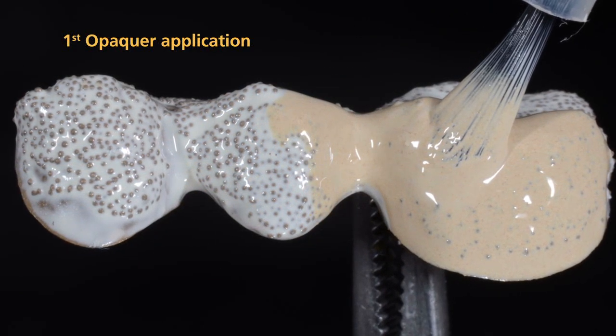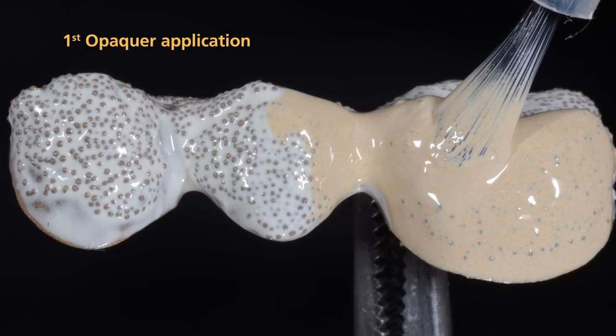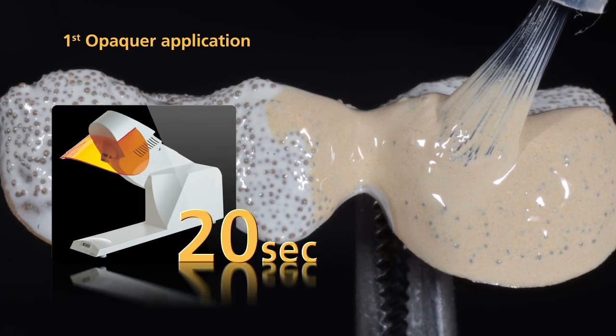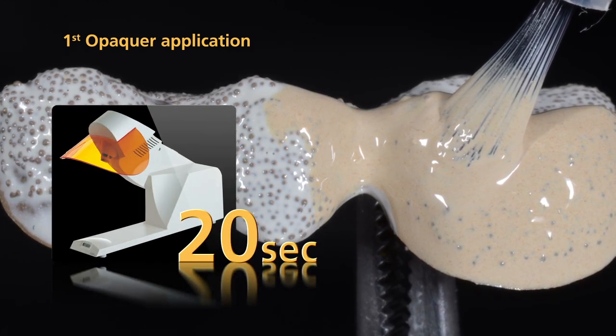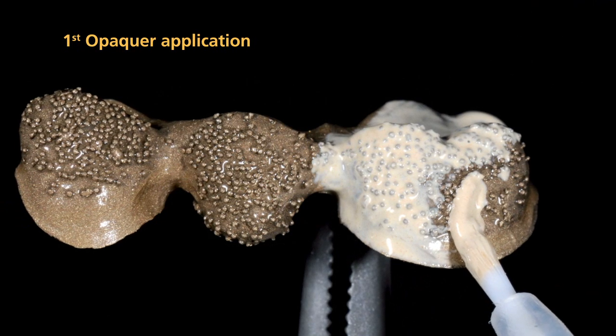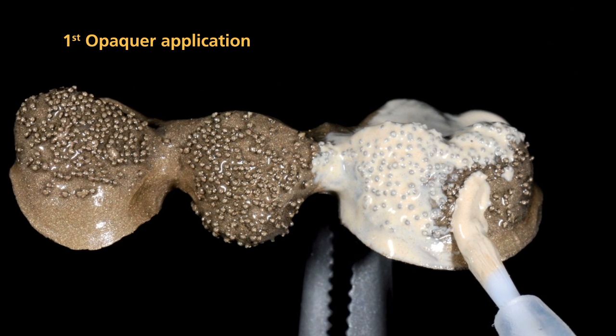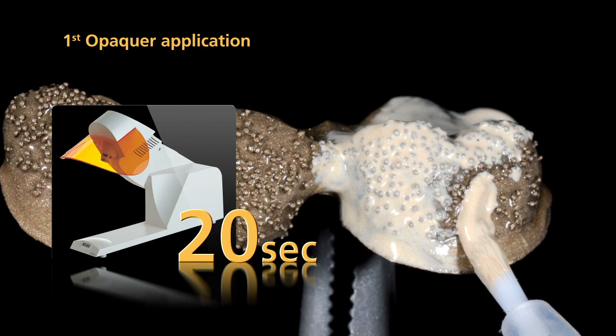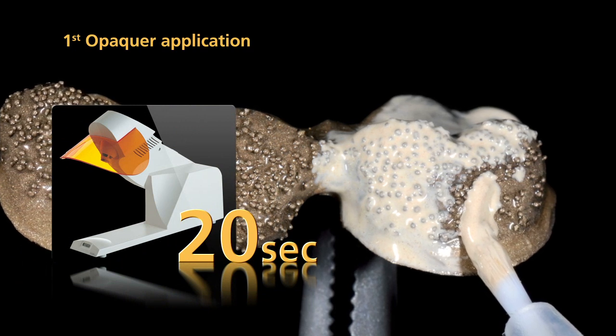Now, apply the first layer of Opaquer in a thin coating using a brush. Pre-cure the Opaquer for 20 seconds with the quick. If you do not use SR-NEXCO retention flow, apply the first layer of Opaquer in a thin coating to the metal framework. Subsequently, pre-cure each segment for 20 seconds with the quick.